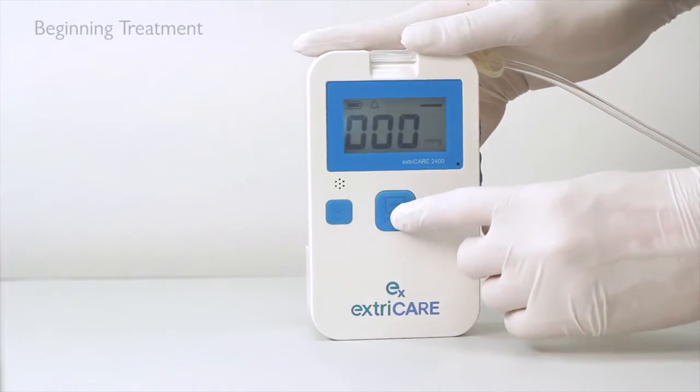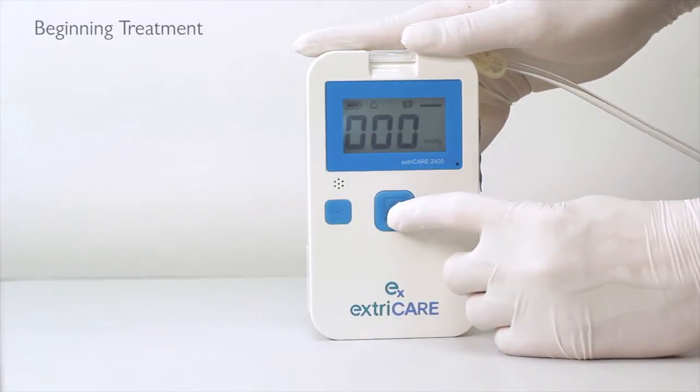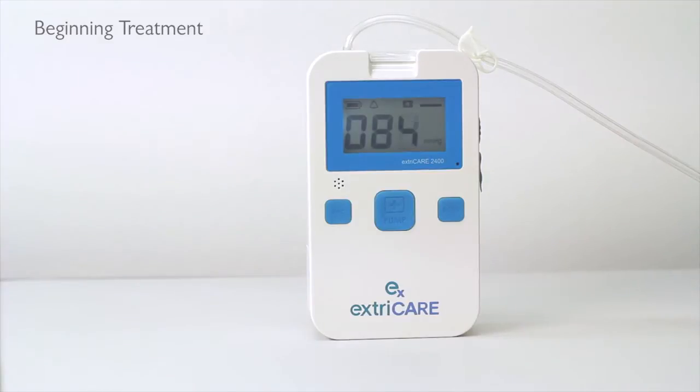Once the desired mode is selected, press the PUMP button to confirm. To begin treatment, hold down the PUMP button until you hear a beep. You will hear the pump begin to operate. Once the correct pressure level is achieved, the device will begin treatment.